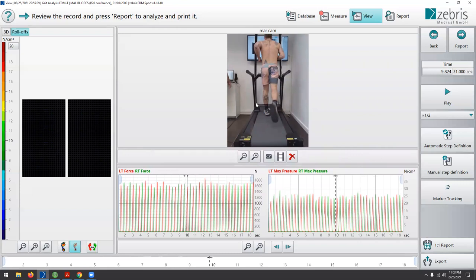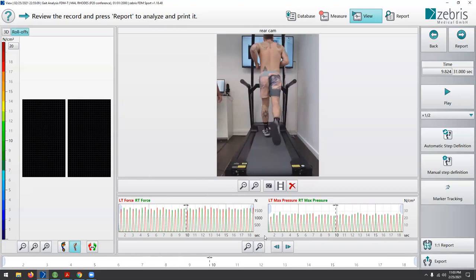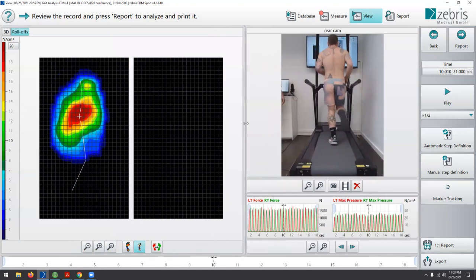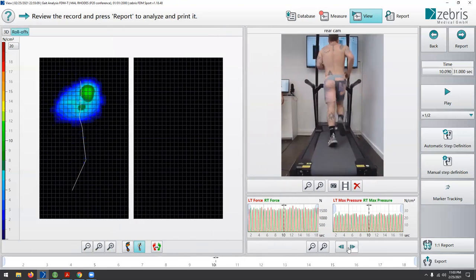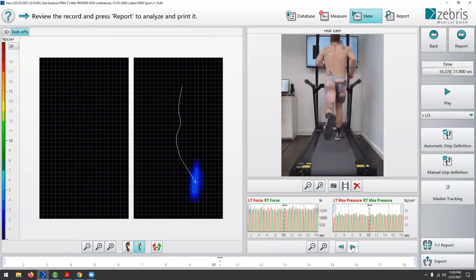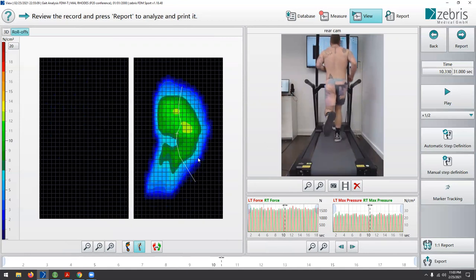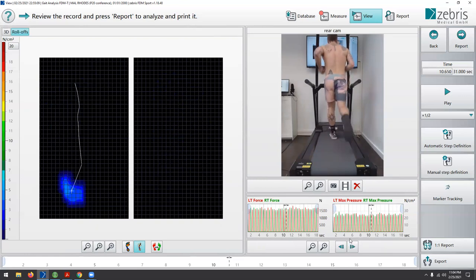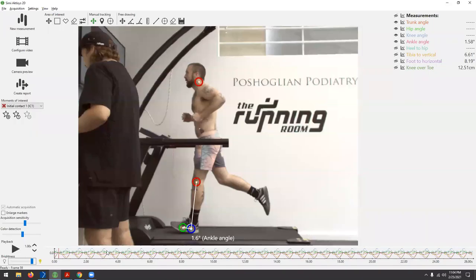I also take a deeper dive into toe-off — are we getting engagement through the first ray and the big toe when someone runs? You may see someone toe-off very laterally without loading through the big toe. We also always complete an objective assessment off the treadmill, looking at tissue capacity and joint range of motion in the relevant structures.